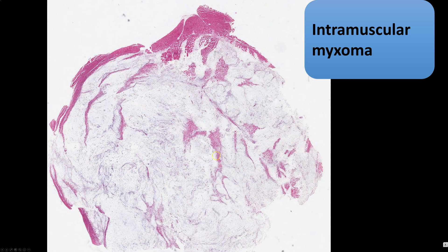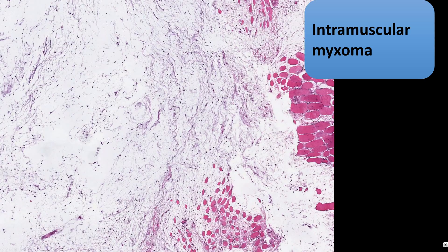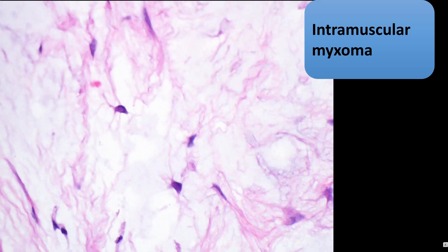Here's a quick look at an intramuscular myxoma — you can see it's splaying apart the skeletal muscle bundles and it's very hypocellular. And here's the characteristic cell you can see in both intramuscular myxoma and superficial angiomyxoma: a bean-shaped nucleus with a little blob of pink cytoplasm.